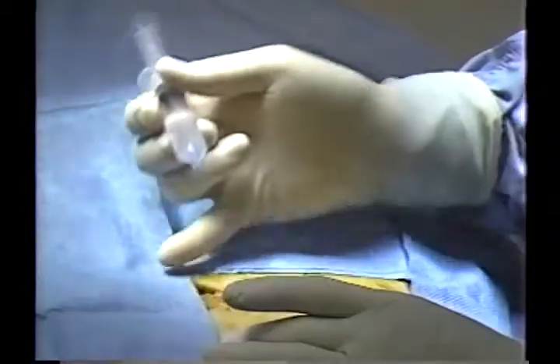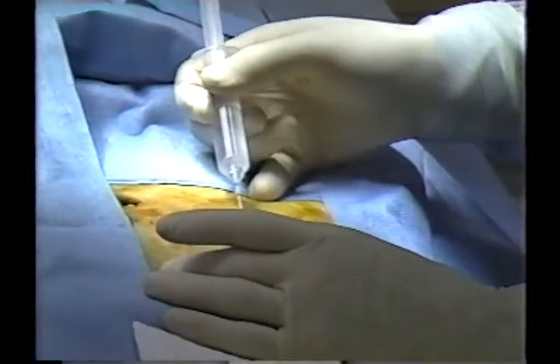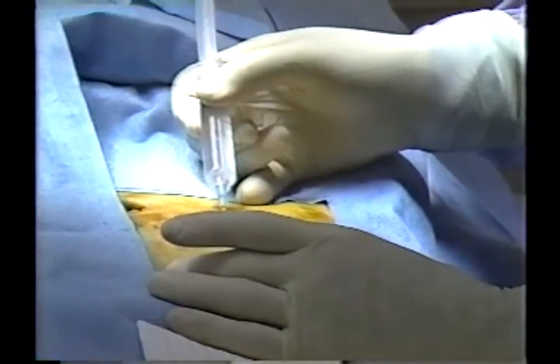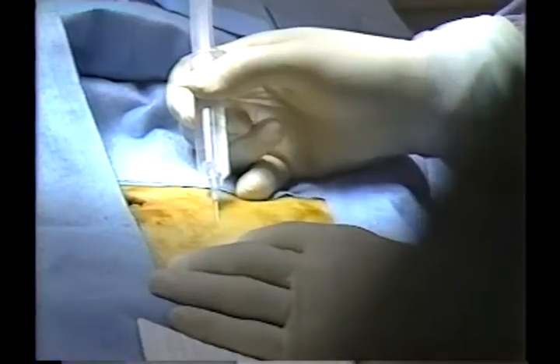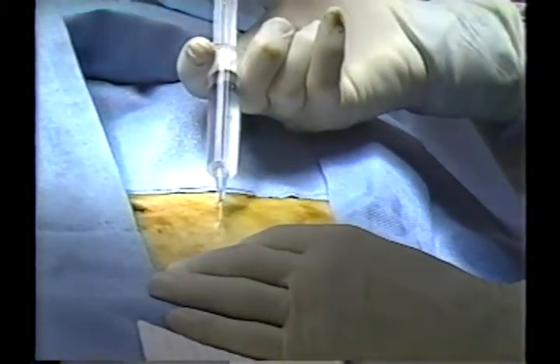In this patient, the choice of catheter entrance site is 1 inch below the umbilicus and the left mid-rectus sheath. The patient had a previous catheter on the right side, which was removed 10 days ago. The skin is anesthetized with 2% lidocaine.